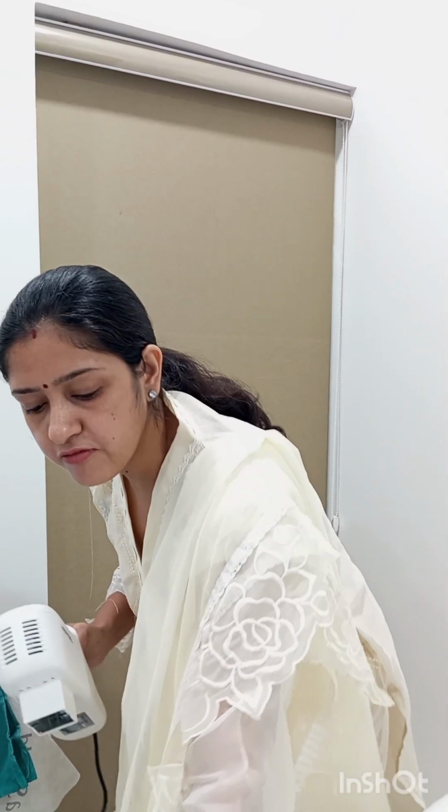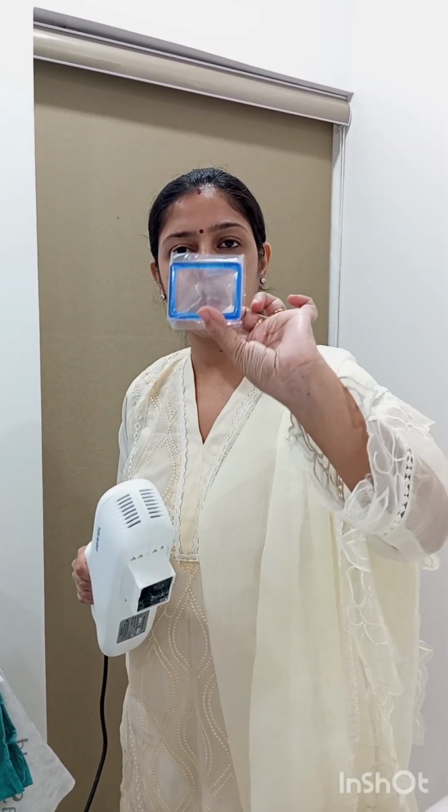What do you mean by targeted or focused phototherapy? That means the patient will receive the UV radiation only at the lesional site and not on the normal skin. Only the lesional area will be exposed to the UV radiation, while the rest of the non-involved area will be protected from the UV radiation. Now, depending upon the size of the lesion, you can put various filters. Various filters of various sizes are available along with the machine, and depending upon the size of the lesion, you can put the appropriate filter onto it.